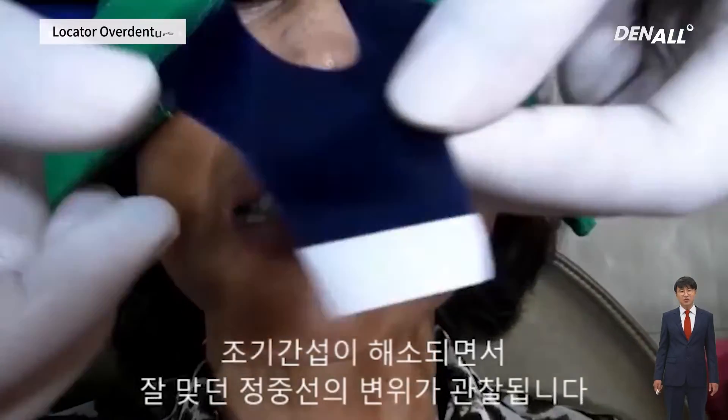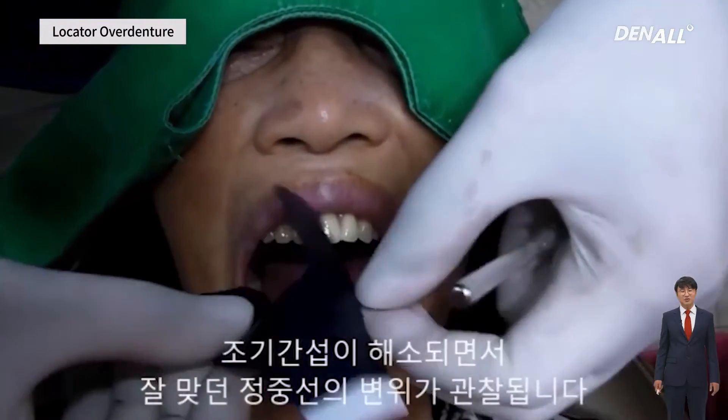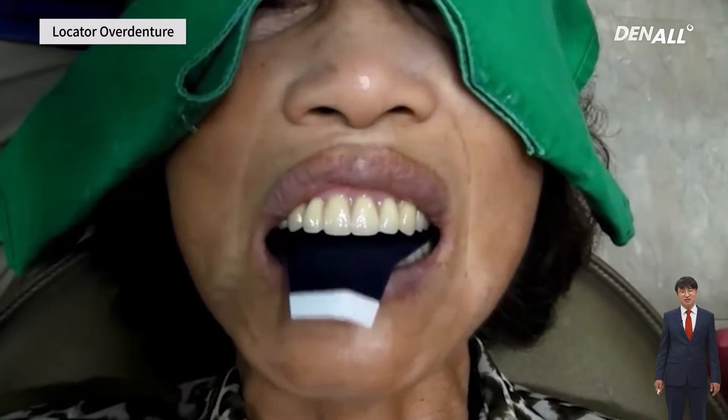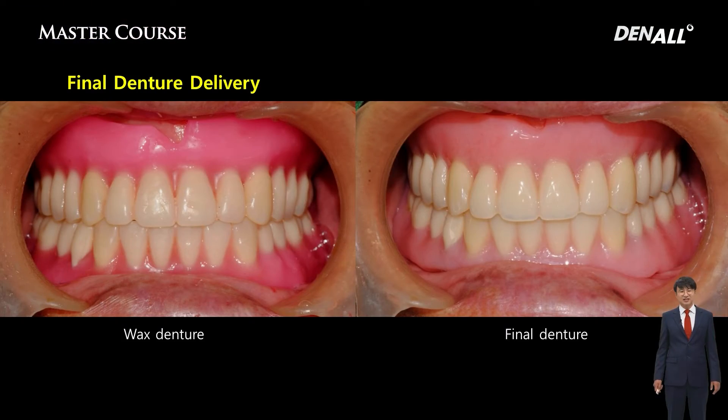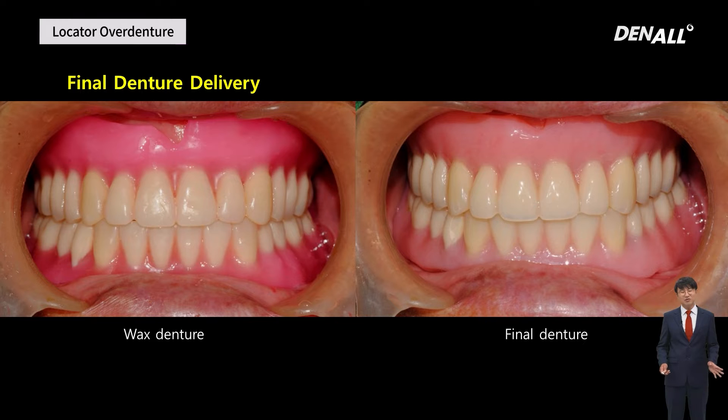Without sliding, you can see there is good occlusion, so it seems that problem has been resolved. However, there was another problem: the midline had moved. I really took a lesson from this. If I had known about the hidden slide, I should have taken the impression again. By reattaching at the chair side, you can sort of make an adjustment, but there is an aesthetic consequence — the midline moving and some changes in the overjet. Chair-side adjustments should only be done in inevitable cases, and if you see a problem in the extension, you have to fix it then and there.